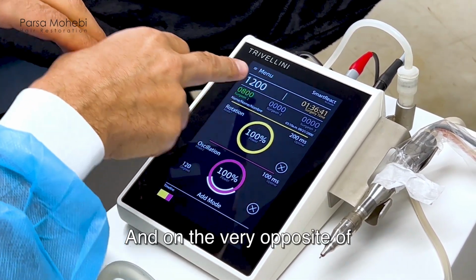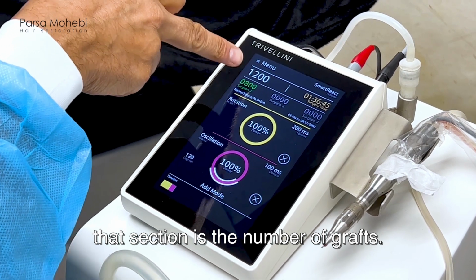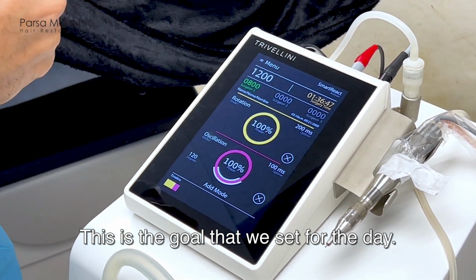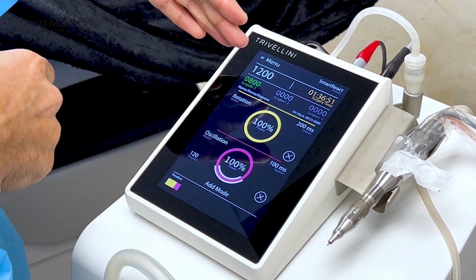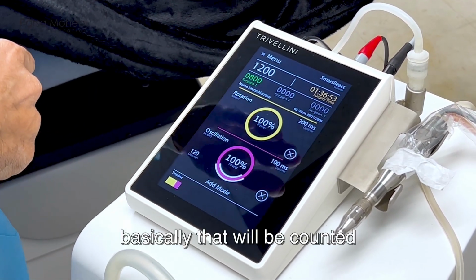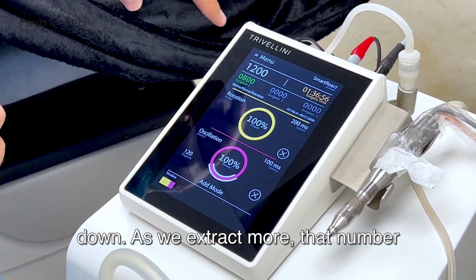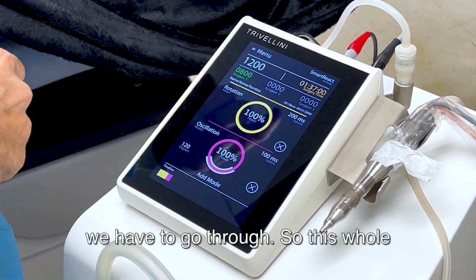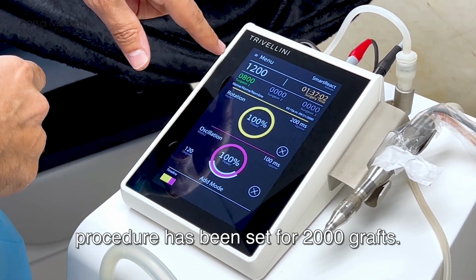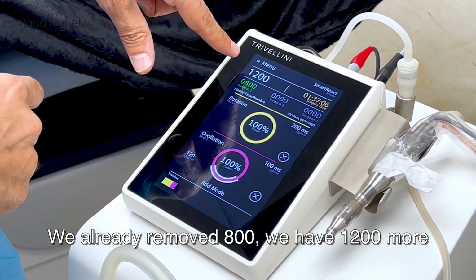And on the very opposite of that section is the number of grafts. This is the goal that we set for the day, so we know how many grafts we need. That will be counted down as we extract more. That number goes down and it shows us how many more we have to go through. So this whole procedure has been set for 2,000 grafts. We already removed 800, we have 1,200 more to go.